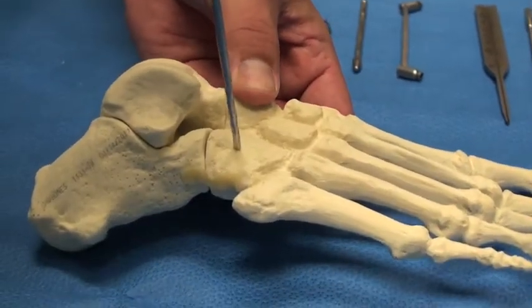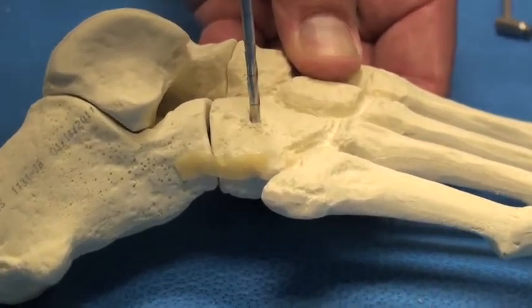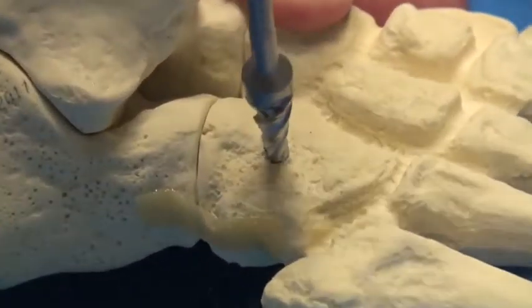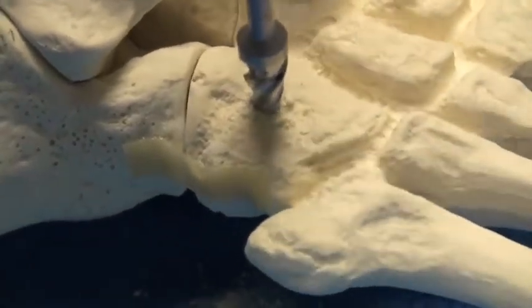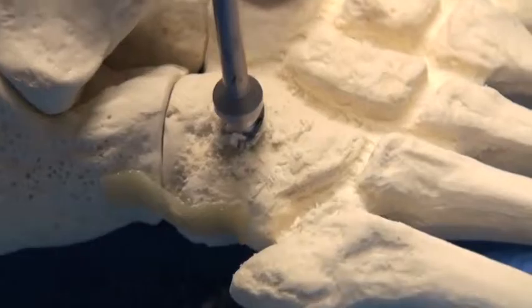After guide wire insertion, it's very important to drill bicortical, as the post itself is not designed to be self-drilling and it can strip. At this point, the drill hole will be reamed for insertion of the post. It is important not to ream on power but to use hand, as the reamer is exceptionally sharp and can bury right through the bone.